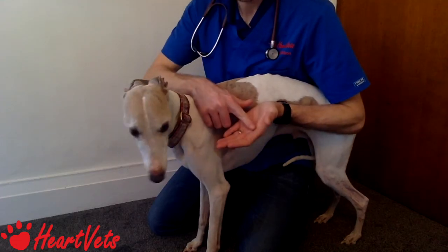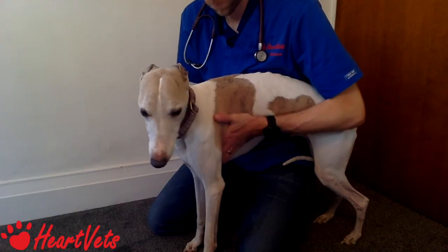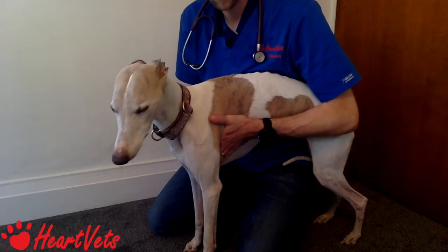Before you put your stethoscope on, put your hand on the patient's chest over the apex beat. Try using the palm of your hand, not your fingertips — it's probably more sensitive to subtle vibrations. Feel for the strength of the apex beat, as a strong beat may mean the heart is enlarged or under an increased load, while a weak beat may mean cardiac function is reduced.